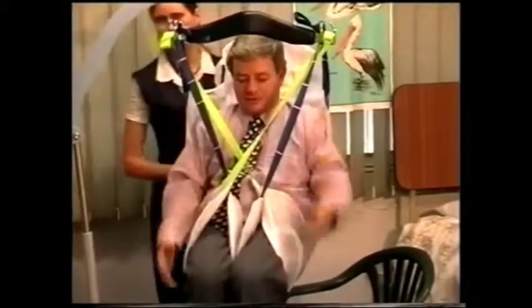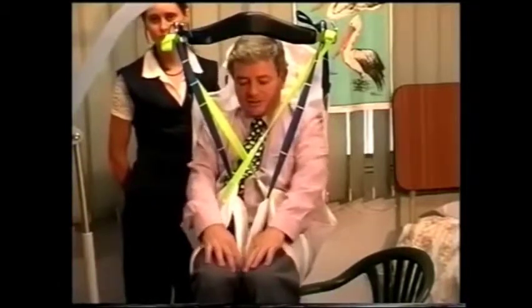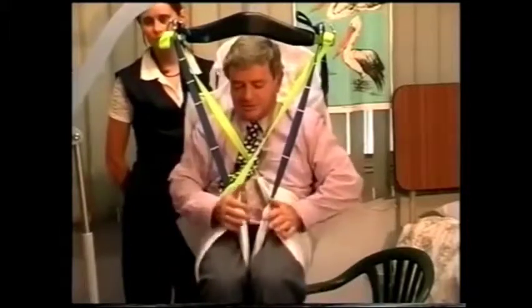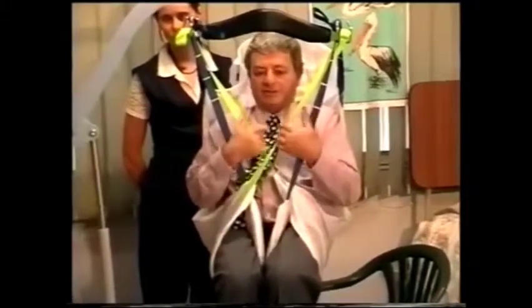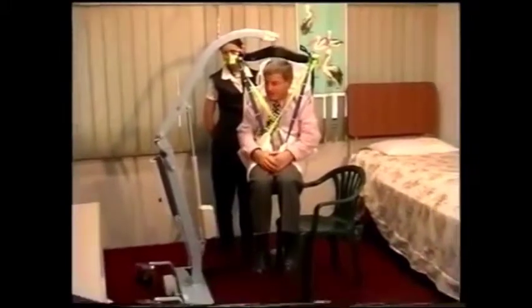See how they cross over there? Now that's holding my legs in a little bit tighter than the last time, but you can still open up the legs for washing. But it just keeps the legs in neatly there. And some people feel more secure that they've got that holding around there. And once again, they've got the webbing in front of them, they can hold on to the webbing. And I'm sitting pretty upright.